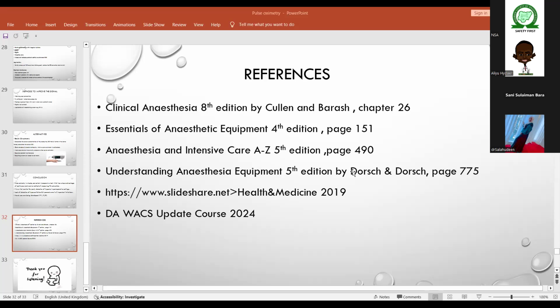Because it's a fraction of the other abnormal hemoglobin, other species of hemoglobin in the arterial blood. So it's a fraction we are getting actually. And this fraction is also relative to the calibrated figure in the machine. Okay, but if we have another question: co-oximetry analyzes each variant of hemoglobin.